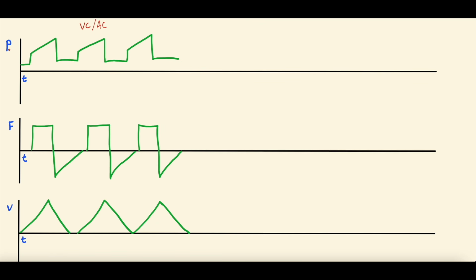This is the pressure scalar, right? So you have this set pressure, the PEEP, and the ventilator increases the pressure as they're getting a breath. It kind of flattens out here and continues to increase as they're getting a breath. Breath's done, it goes down to the set PEEP, which is the lowest pressure, the end expiratory pressure, and then a new breath starts. So each one of these is a breath, and that's a normal pressure scalar in someone in volume control. Here's the flow scalar.